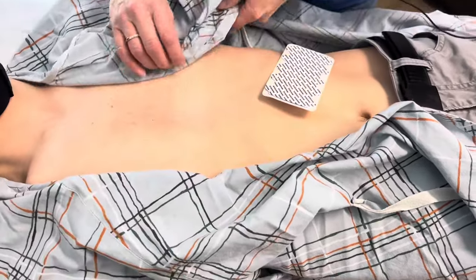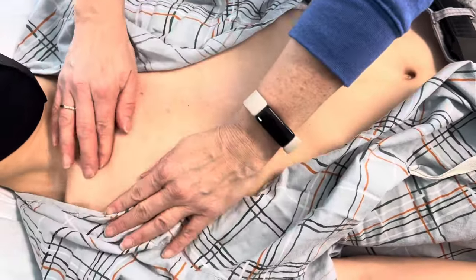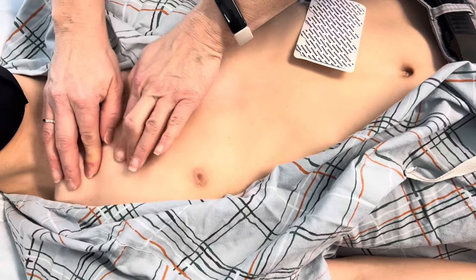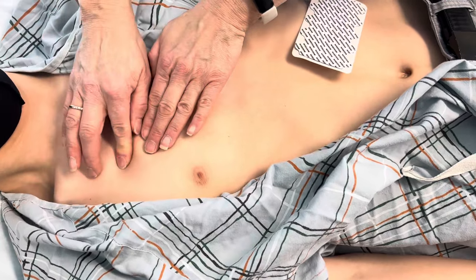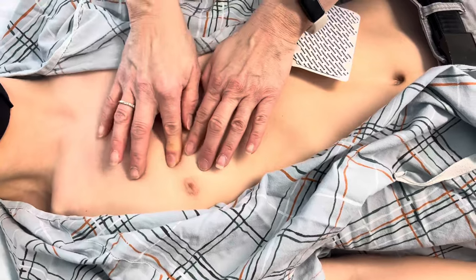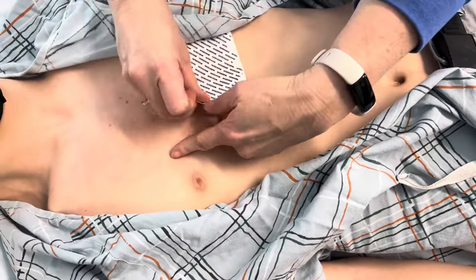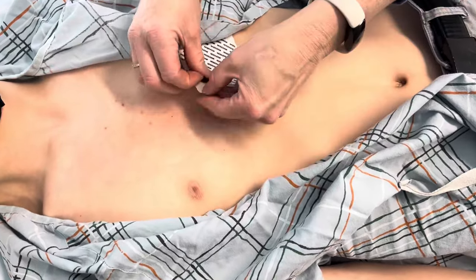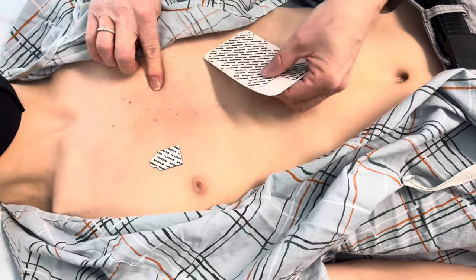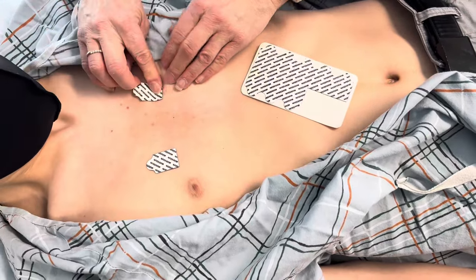The first thing you want to do is find the fourth intercostal space. Walk down — intercostal means between the ribs — one, two, three, four. That's where the first lead goes: V1. Then put one on the opposite side for V2.